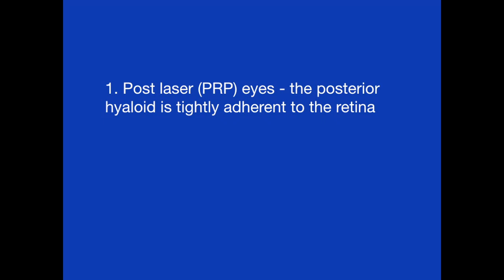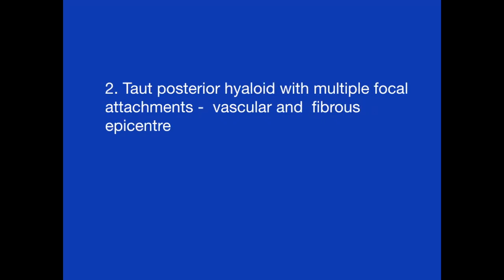The first challenge is in post-PRP eyes, where the posterior hyaloid is tightly adherent to the retina. Second, taut posterior hyaloid has multiple focal attachments in the form of vascular and fibrous epicenters.